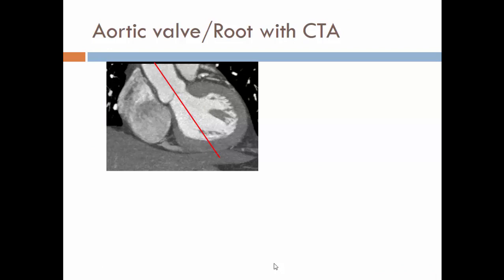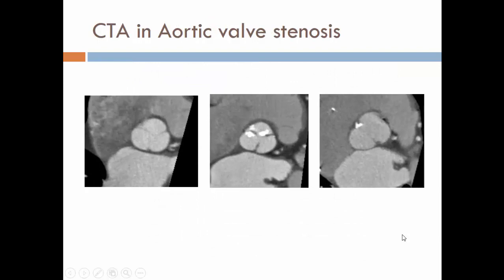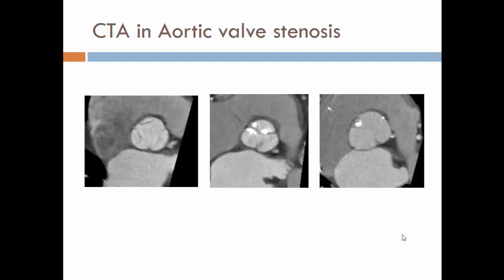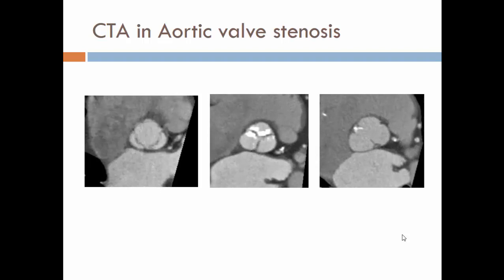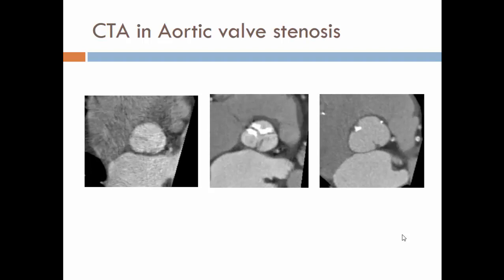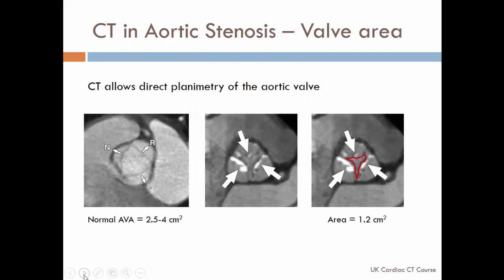To assess the aortic valve on CT, we create double oblique views through the aortic valve in a true short-axis plane. If the study was acquired in retrospective mode, the valve can be assessed as a moving object. The morphology of the aortic valve is so clearly demonstrated on CT that there is almost never doubt, although in very heavily calcified valves it may be difficult to distinguish a true bicuspid from a tricuspid valve with two fused cusps. In the majority of cases, however, the valve morphology is quite clear.